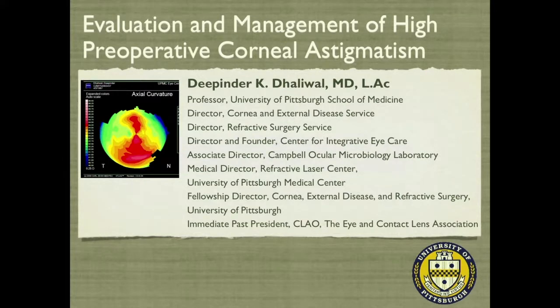Okay, so how many of you feel comfortable doing LRIs at the slit lamp or in the office for residual refractive error, and how do you tackle that? I think it's a great technique, and I've seen Eric Donenfeld do that. I remember early on, I saw he's got the shorter diamond knife, and you can do that right at the slit lamp. I think that's a great technique, great tool, and it's definitely worth keeping in mind.